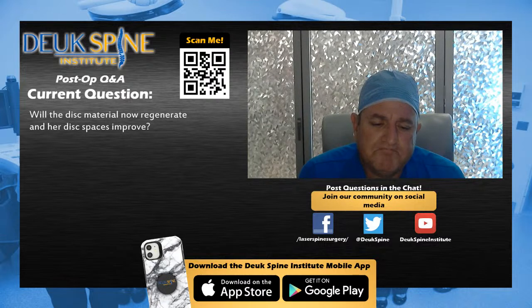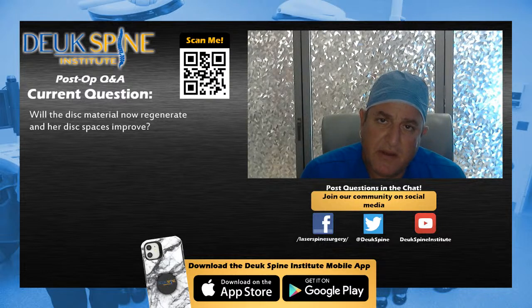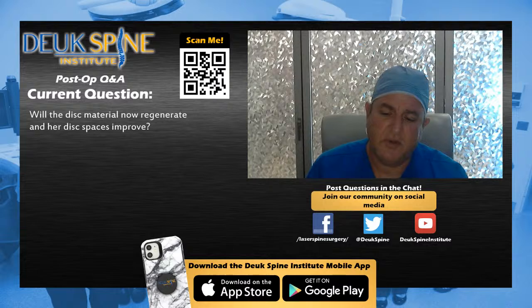When it first happened to me and I got some bleeding years and years ago, it was more concerning than it is today. The reason is that years and years ago, I didn't have as much experience as I do today. And that experience of being in the endoscope, knowing the anatomy, knowing where the nerves are, where the end plates are, there's really not a whole lot going on down there. It's pretty much the same in everybody. There's the vertebral body end plates.